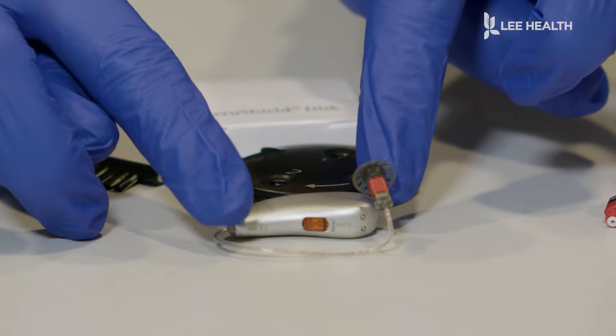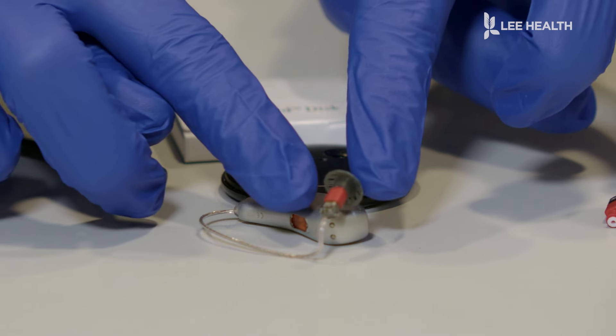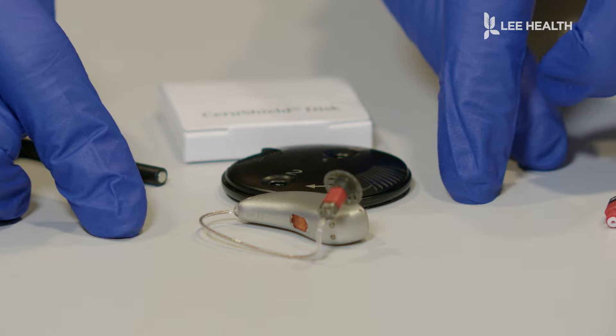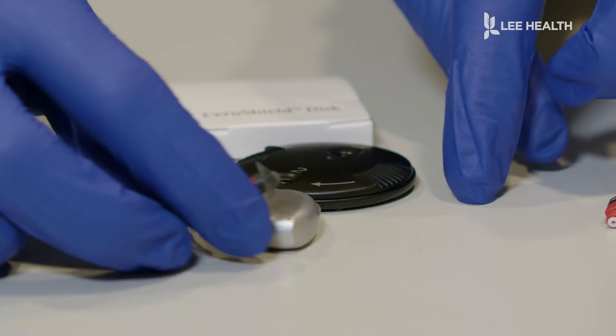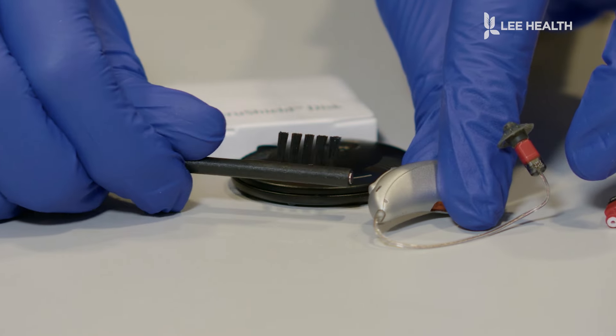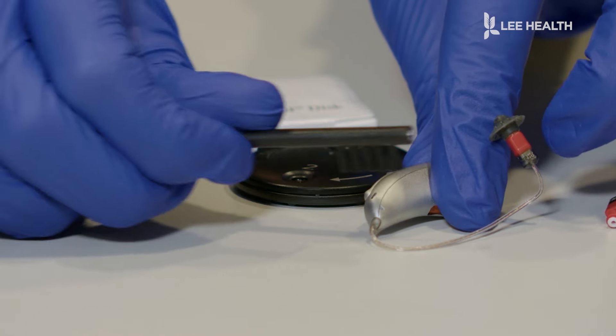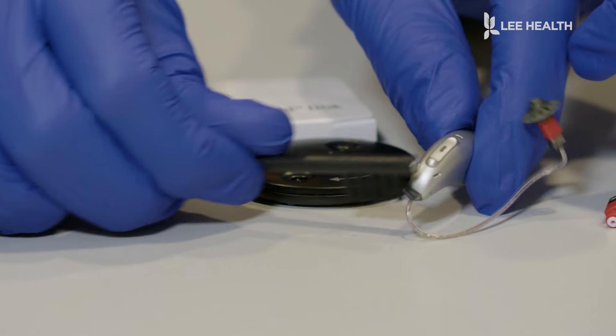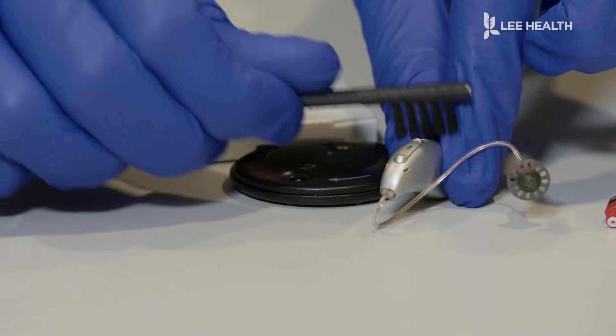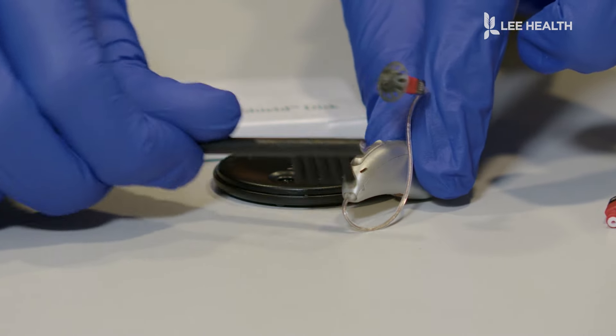If you have this style hearing aid with the thin wire and the removable rubber tip on the end, this is how we're going to clean it. First, I'm going to take the hearing aid here. If you have one of these little brushes, it's kind of like a bristle brush, it helps to brush off the top of the hearing aid where we have these little microphone holes where the sound goes in, just to make sure that's nice and clear of any debris.